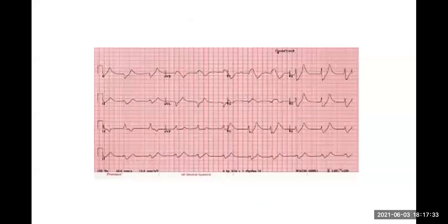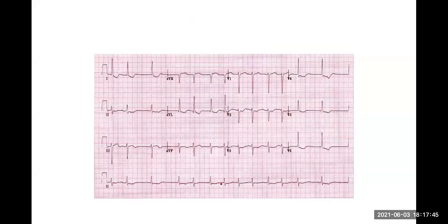This is actually a more severe form of hyperkalemia. Also, you can see the very broad QRS complex, and this is called a sine wave. This patient is seconds from getting a cardiac arrest, essentially.